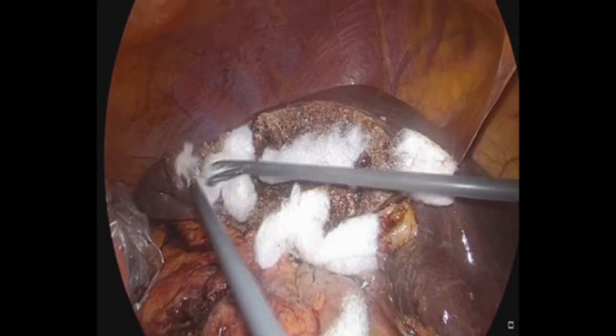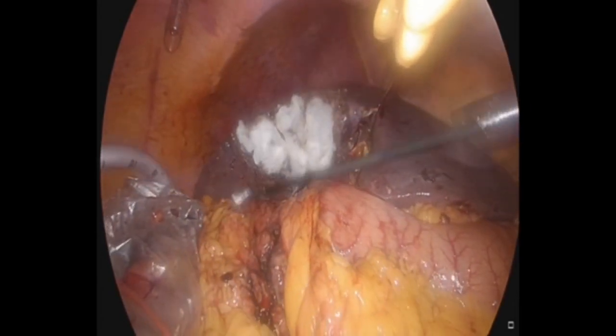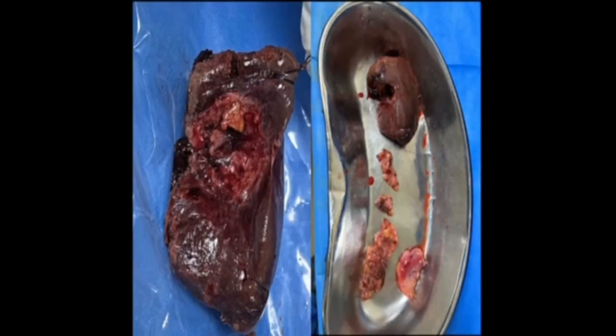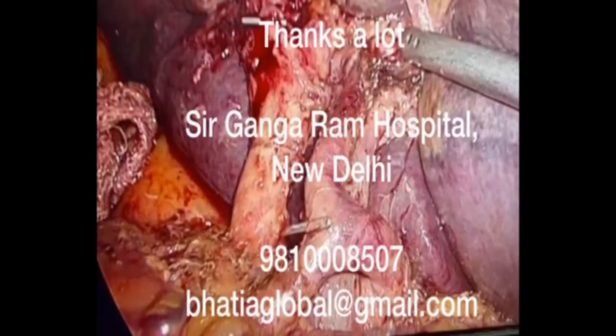After maintaining good hemostasis, Fibrillar is placed in the liver bed, and a 28 French tube drain is placed in the subhepatic space. The liver can be delivered through a supraumbilical extension of the incision in totality, and all the fibro-fatty tissue is also taken care of. The biopsy in this situation revealed that there was no residual tumor, and the patient did well, being discharged on day four of the surgery.